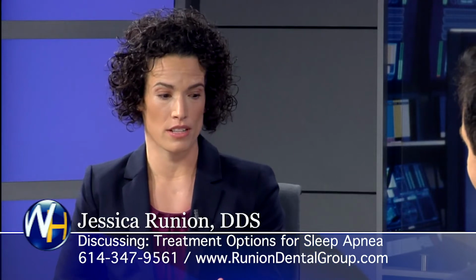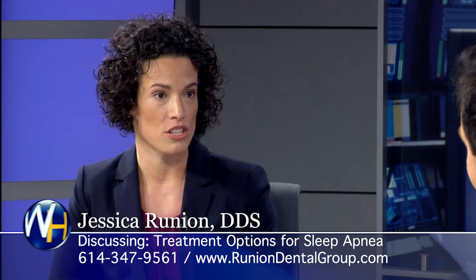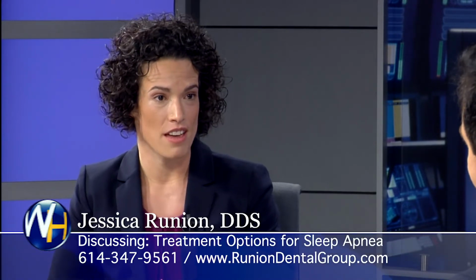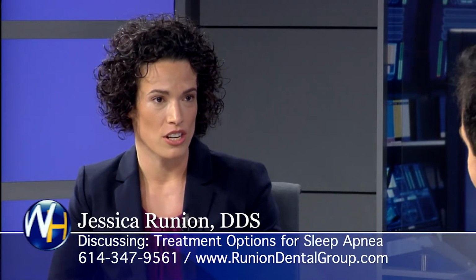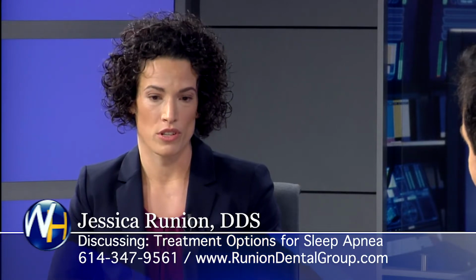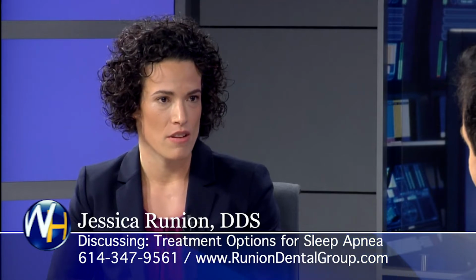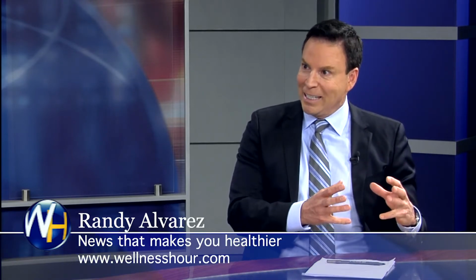It actually does two things. It helps keep their airway open, but it also protects their teeth from clenching and grinding. A lot of patients that have airway problems take it out on their teeth, and there's a correlation between an improper amount of air and clenching and grinding. So we see a lot of patients with significant wear on their teeth, which leads to a lot of other problems, and it helps protect their teeth that way. There are certain people who sleep in different rooms, but after you make a custom appliance that quiets down their snoring, they're sleeping quieter and they're back in the same room.